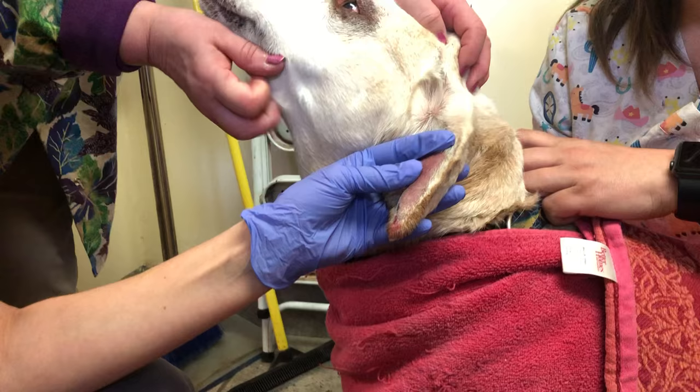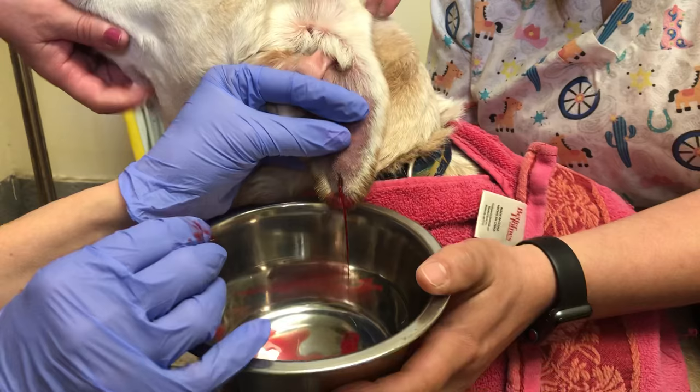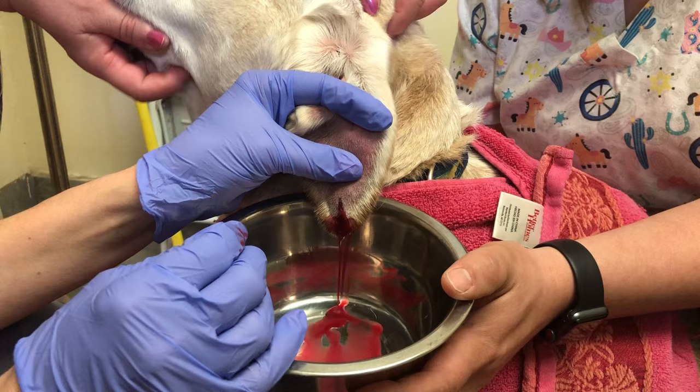So now we're going to make a puncture wound where I put the lidocaine in to drain that ear. That's what it looks like — this is blood inside the lateral and the medial pinna, and that's what's inside these ear hematomas. Some people will just poke them and not put a drain in, but they'll just refill. So you really should put a drain in.